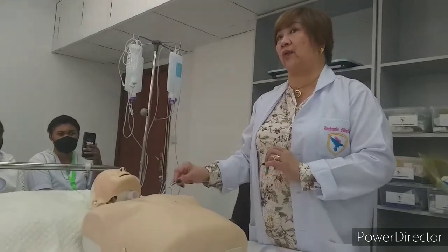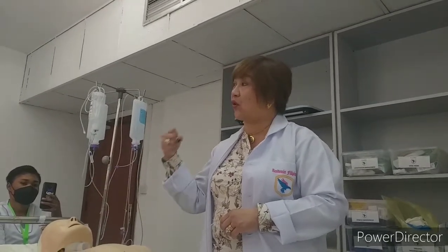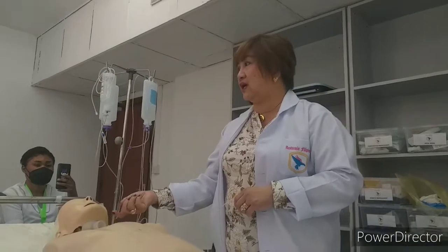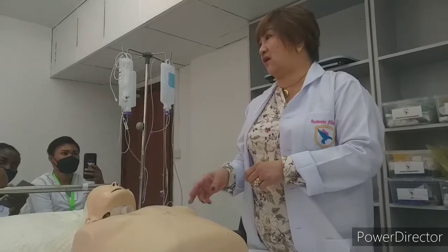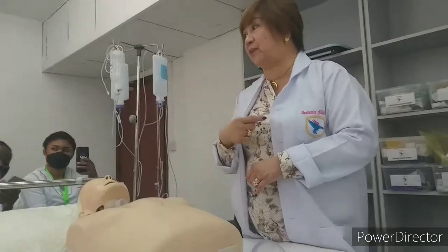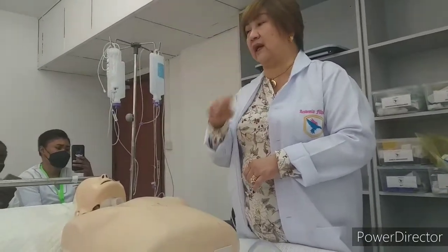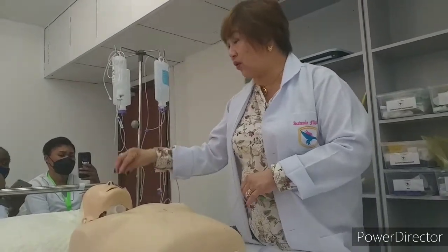So why are we going to do it? Suctioning is the aspiration. When we say something, that goes with what we are going to do. Like suctioning, when you say suctioning, it's going to clean. So why will we suction? To aspirate, to clean. Number one, to clean the pipeway or the airway, to clean the tracheostomy or the nose or the mouth.